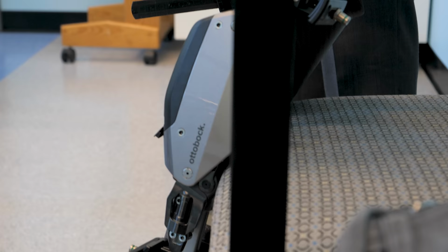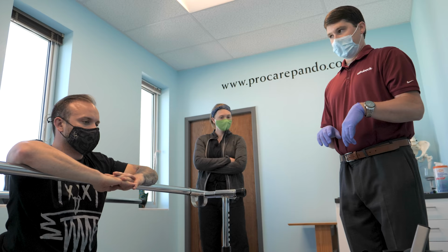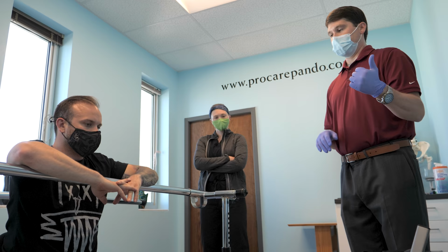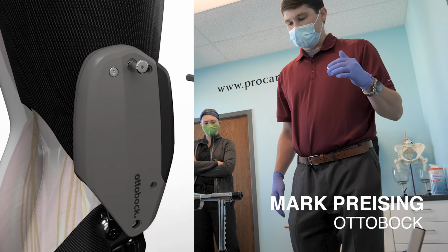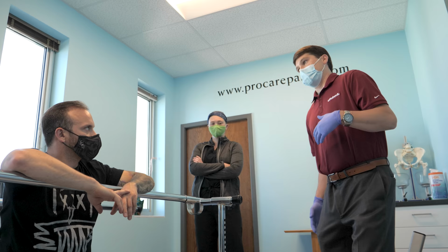There are really three main components of the brace. There's an accelerometer, a gyroscope, and hydraulics. So your hydraulics are sort of replacing some of those quad muscles, and some of your hamstring and glutes. When those muscles are lacking and you take a step and go through swing, and then you stumble and come down while your knee's bent, there's really nothing that will hold you up.